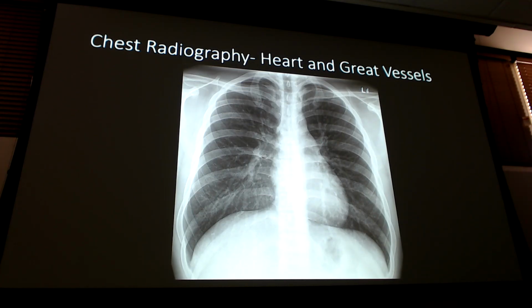Another thing we're looking at, let's count some ribs, right? Do we have enough? Is this adequate for respiration? Well, if I go 1, 2, 3, because if you look here, you see it come down, right? 2, 3, so that's 2, 3, 4, 5, 6, 7, 8, 9, 10. Beautiful. So 1, 2, come up, that's 2. So that means that's posterior 3, 4, 5, 6, 7, 8, 9, 10. We're good. I can stop at 8. I'm good to go. So we got that.